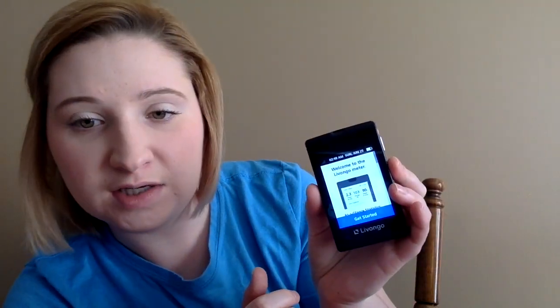Okay, so the first thing, it's finally popped up and it's saying, do you want English or Spanish? We're gonna hit English. Do you use insulin? Yes. And this is welcome, get started. Let's do your first check. Let's do it. Next, get your lancing device ready. Hey, it's called a lancing device, heads up.